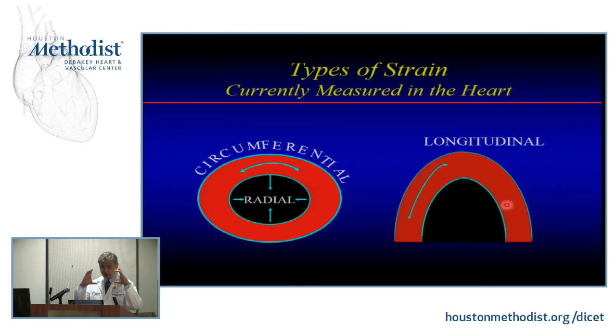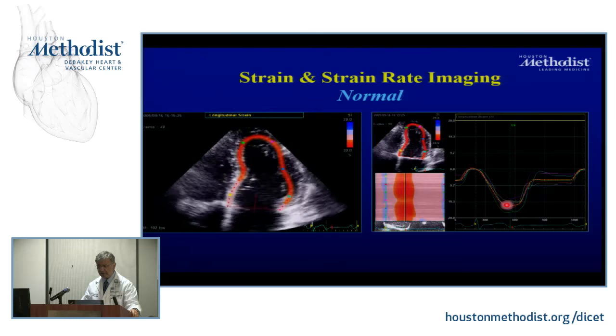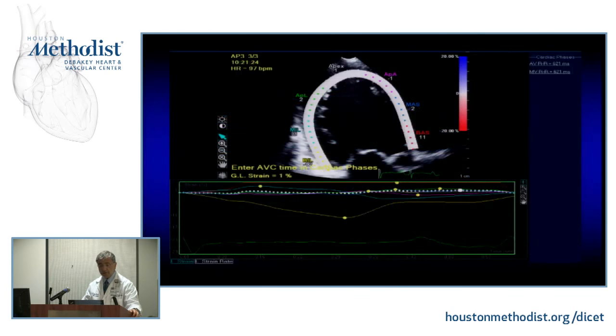There is circumferential and radial coming in, right? So you take an example of a patient with hypertrophy. Longitudinal strain goes down, but radial strain goes up. That's why ejection fraction kind of stays the same or is hyperdynamic. And nowadays, all these can be computed electronically without you, but they are also dependent on noise. You have to always, with your expert eyes, take a look at that and make sure that the data is correct and accurate.